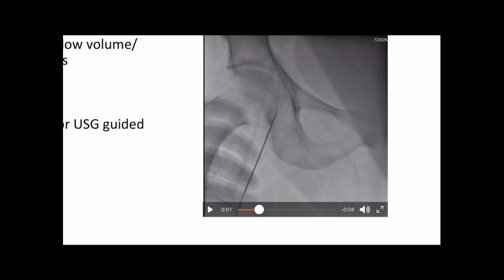So what can it really create problems with? Putting a sheath may distort the local anatomy, and it can create trouble with taking a venous access. The second problem is that when you are puncturing, you are going blind. So there could be a possibility that your needle may puncture the sheath which is already placed in the artery.